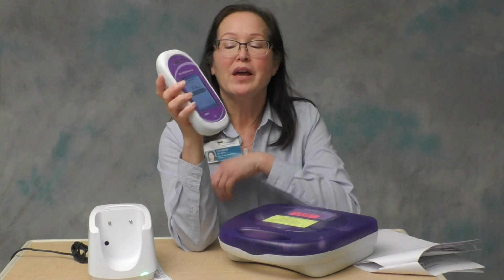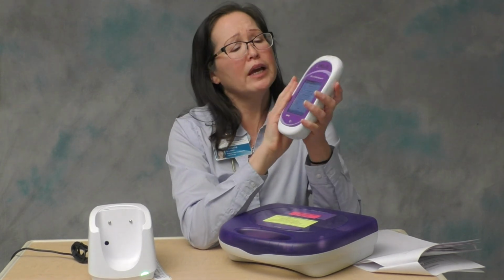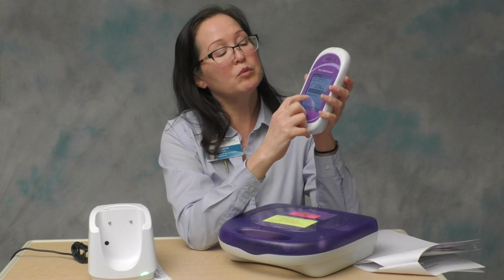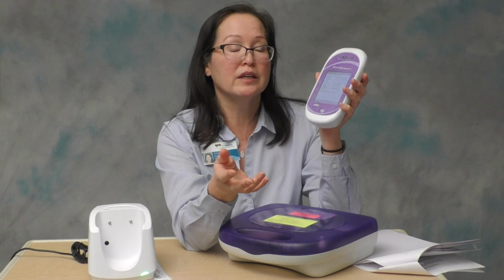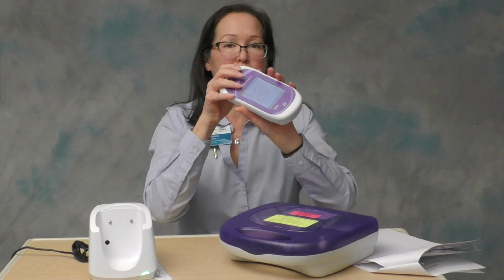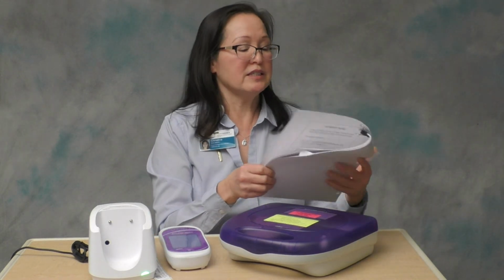So I'm going to go over here and hit that comment button, and I'm going to say that the patient was symptomatic. All right, and I'm going to hit the green check mark, and then you'll see your result with your comment underneath it, patient symptomatic. So hit the green check mark. Now that's going to go to the patient's chart in Epic, and that comment is going to be attached to it. So that's how you're going to do your patient test.